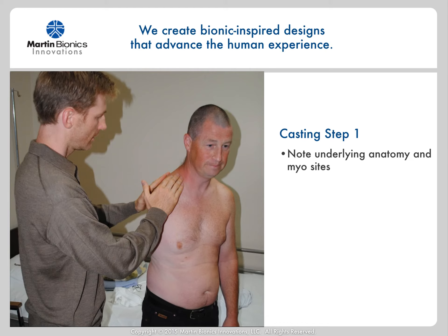Now that we have a good understanding of the fabric socket design, we're ready for casting. In conventional shoulder level sockets, we are fitting the carbon fiber frame to bear the load. But in this design, the fabric is bearing the load and the stabilizing unit frame is merely just holding orientation around the body and becomes a mounting point for the prosthetic arm.